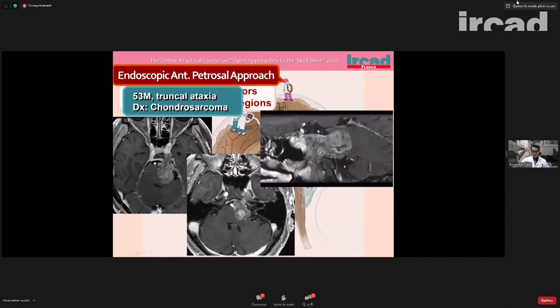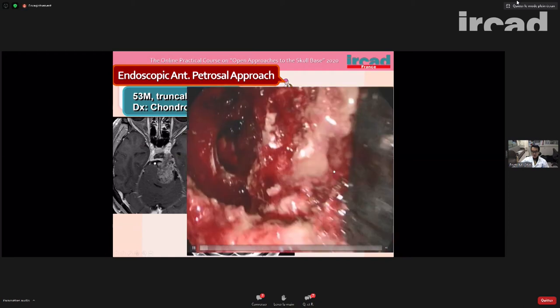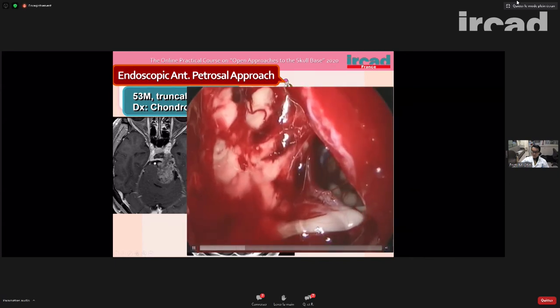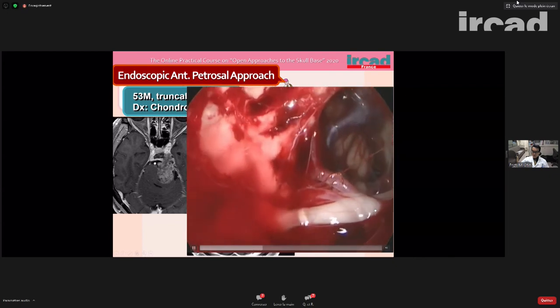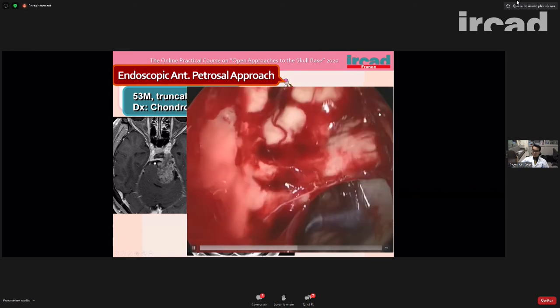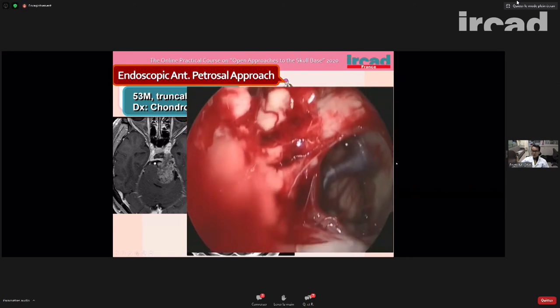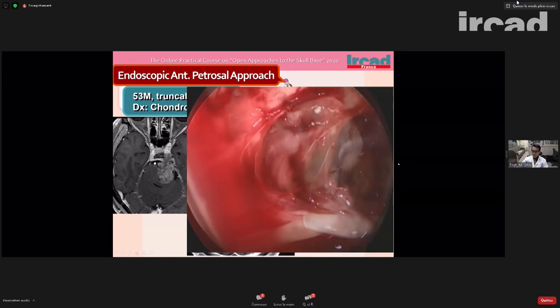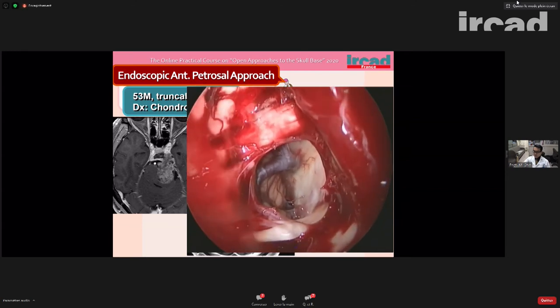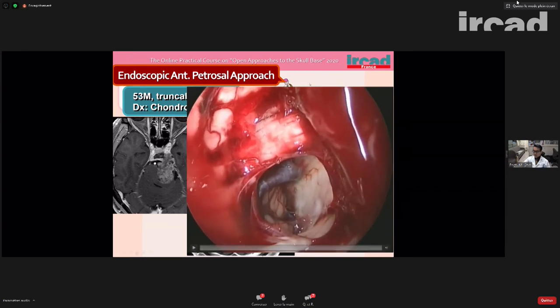So in such a case, this one is a chondrosarcoma case. After tumor removal, we can clearly see the facial nerve and the acoustic nerve here, the petrous vein here, and the trigeminal nerve here. I think in this way, we can reach the CP angle, the cerebellopontine angle, but maybe it's difficult to reach the internal auditory meatus. But we can remove the tumor in the cerebellopontine angle and the cerebellomedullary angle.